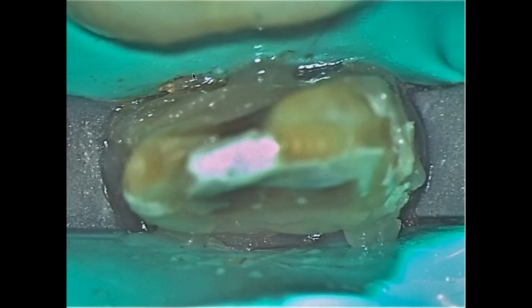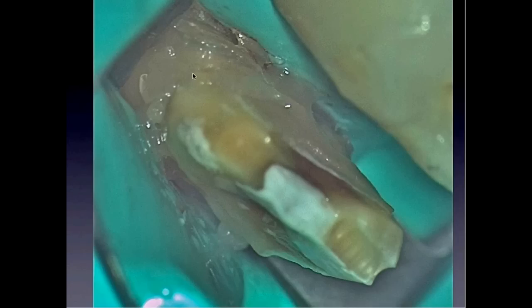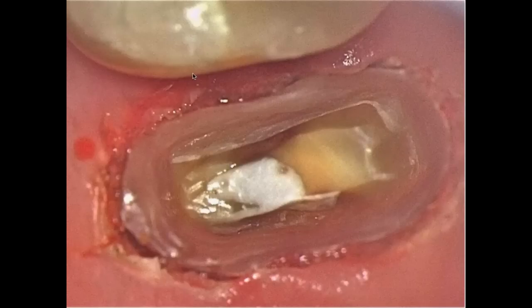I turned on the yellow filter and filled the tooth. It wasn't quite easy to get it filled everywhere and without any bubbles or empty spaces. And then it was prepared with some other positions, and then it was prepared and finished off. And I had a check on it 2 days ago, and it was still okay. There was no pain, and it's still vital.